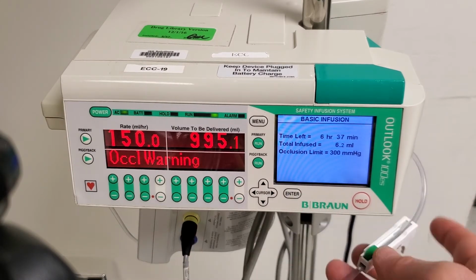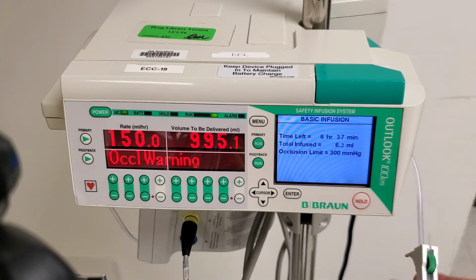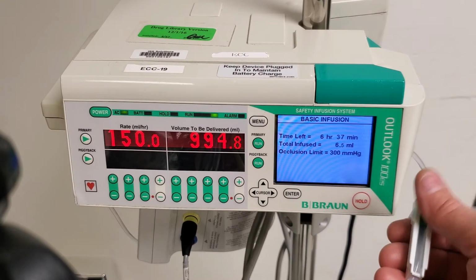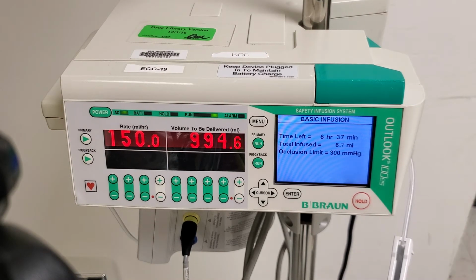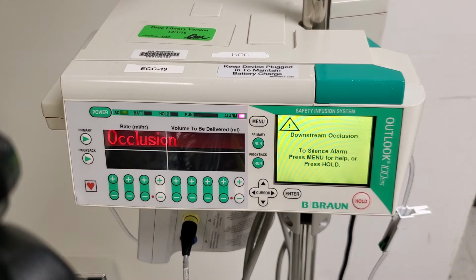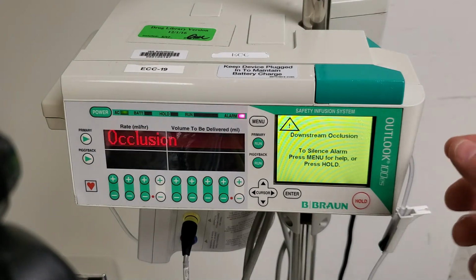So we have an occlusion warning this time. If we eliminate the occlusion, the pump just keeps running. If the occlusion is not eliminated, this could be because the catheter has clogged, or the wheel of the stretcher is on the tubing again. If the occlusion doesn't almost immediately clear, the pump will stop. So downstream occlusion. And we didn't do this on the last error, but it operates the same way.